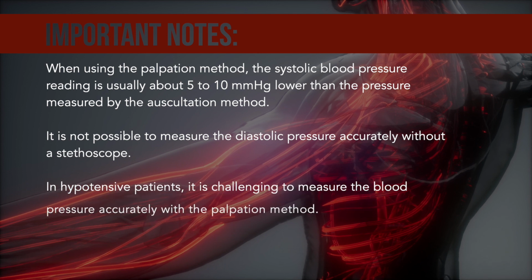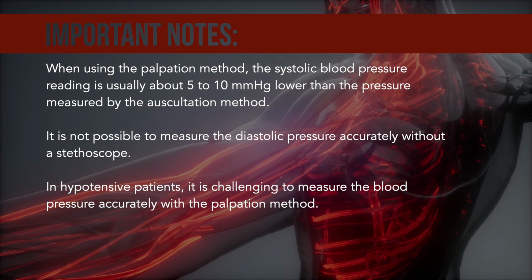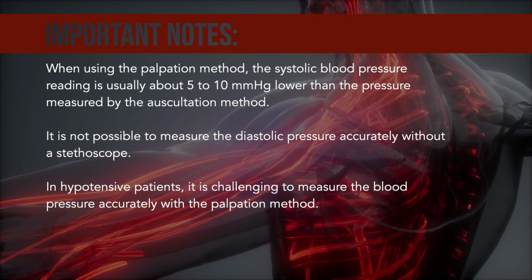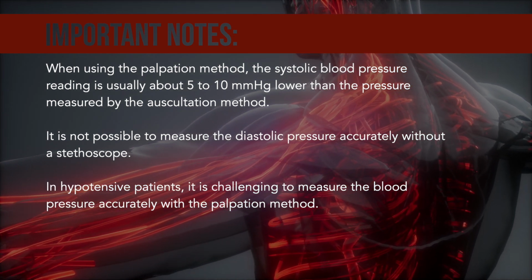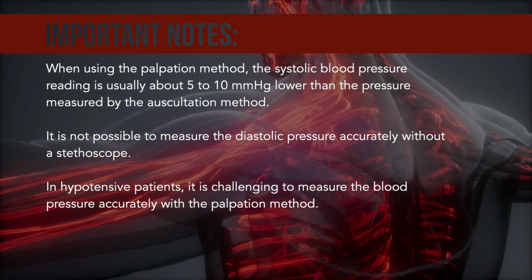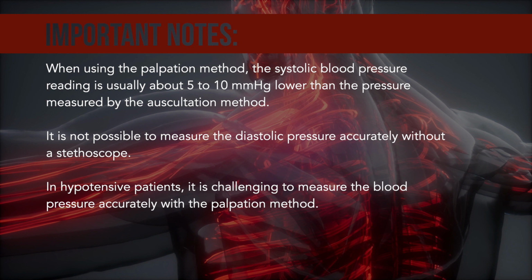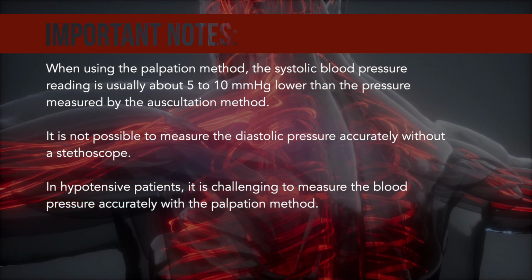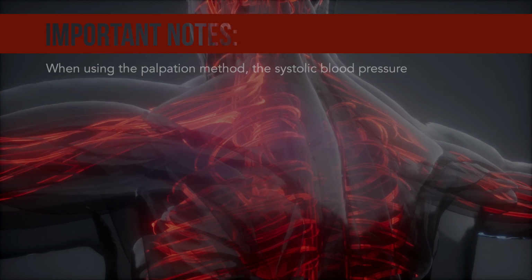Important notes: when using the palpation method, the systolic blood pressure reading is usually about 5 to 10 millimeters mercury lower than the pressure measured by the auscultation method. It is not possible to measure the diastolic pressure accurately without a stethoscope. In hypotensive patients, it is challenging to measure the blood pressure accurately with a palpation method.